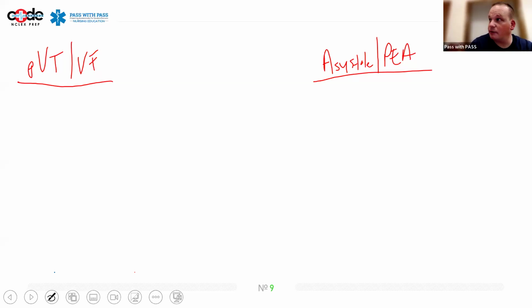So pulseless VTAC and VFib, obviously the very first thing we need to do is recognize it. Well, we need to start CPR. We need to defibrillate as soon as possible. Again, when we see that pulseless VTAC or VFib, that's our window of opportunity. As soon as I can defibrillate the patient, I am going to defibrillate the patient. And then we are going to get into our epi.